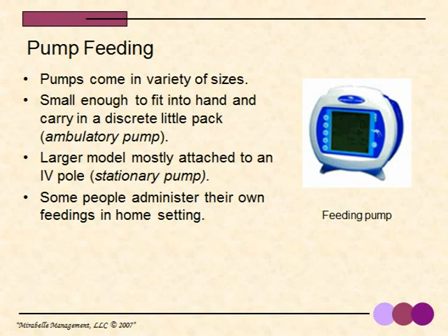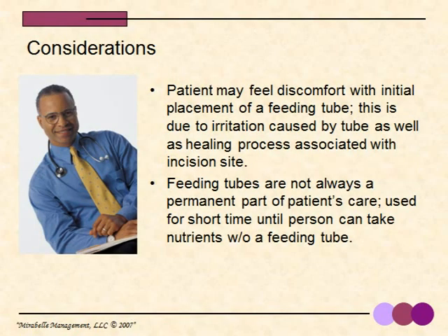There are some people who administer their own feedings in the home setting. I'd like you to be mindful that a patient may feel discomfort with the initial placement of a feeding tube, regardless of the type or the method used. This is due to irritation caused by the tube, as well as the healing process that the body will go through when an incision is made for the tube.